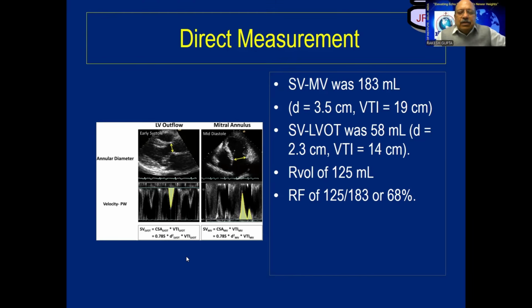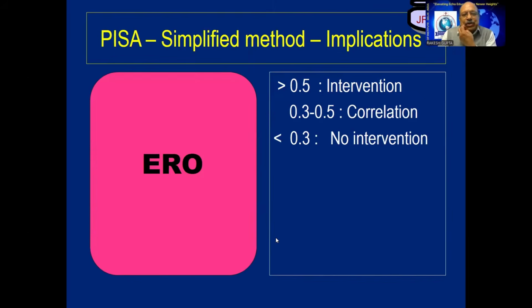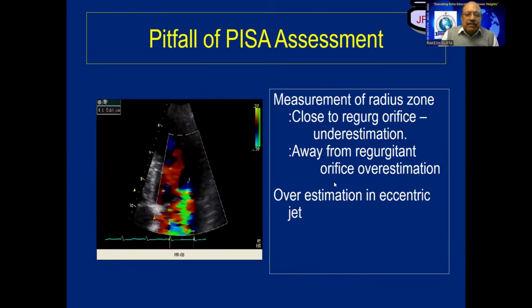Next is Dr. Rafat, online 2. Rafat Zahan, if I'm correct. Good evening, sir. Good evening. Sir, I want to know measurement of PISA in MR. Rafat, are you doing echocardiography already? Yes, sir. I have not shown PISA deliberately, but let me just show you if he asks me. Absolutely no objections for that.